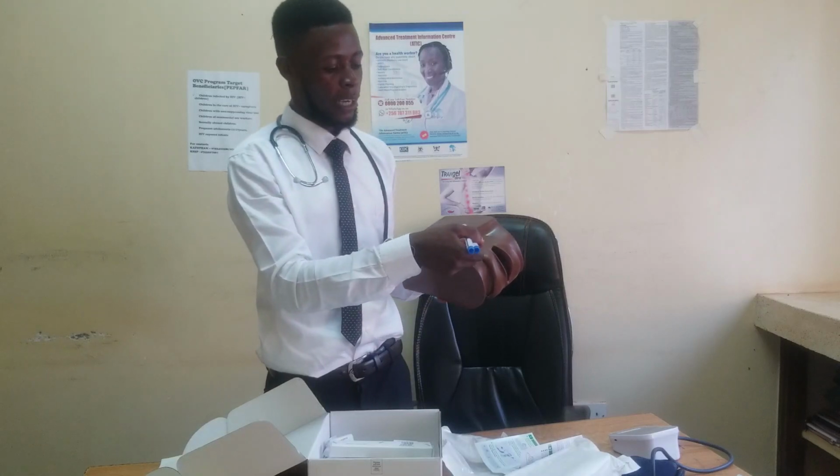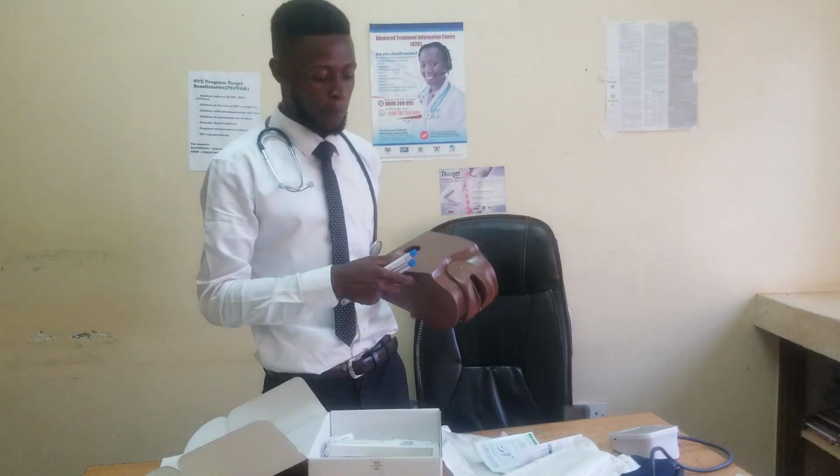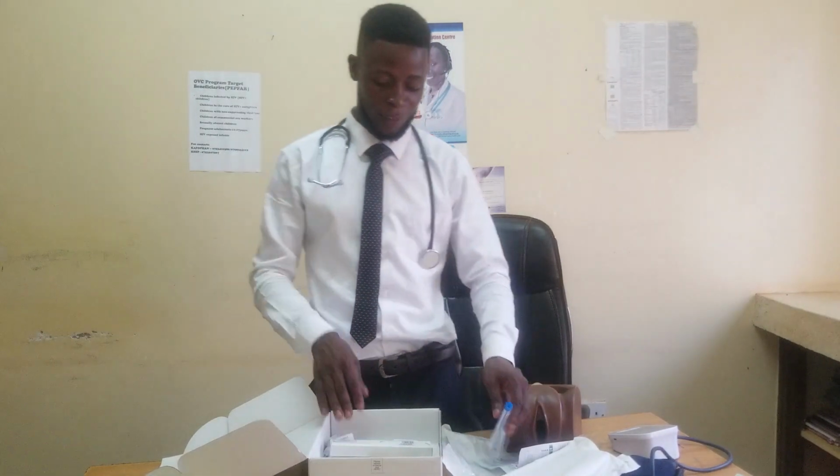This is the prone knee chest position. The prone knee chest position is what we use. So you have the swab that we use around the anus and the one that we push inside, the deep anal swab. So please don't use any string today.